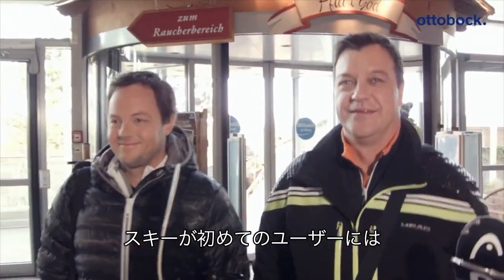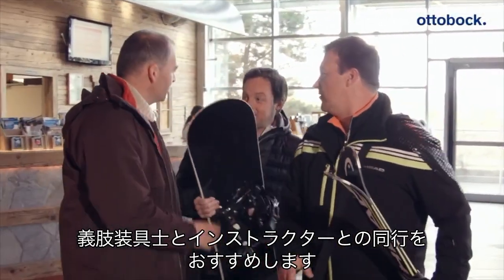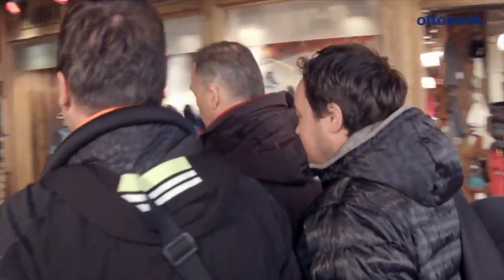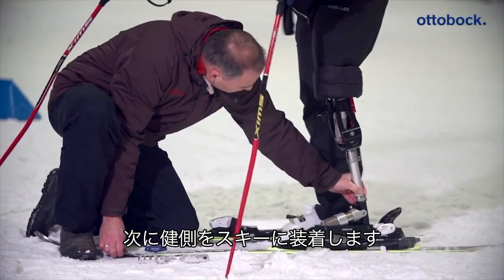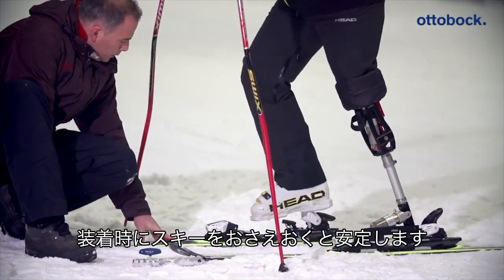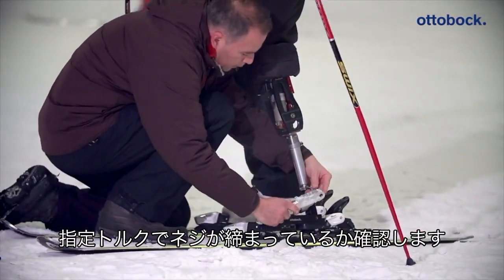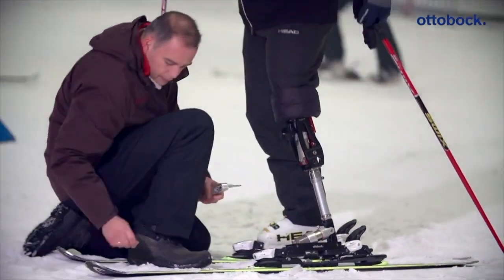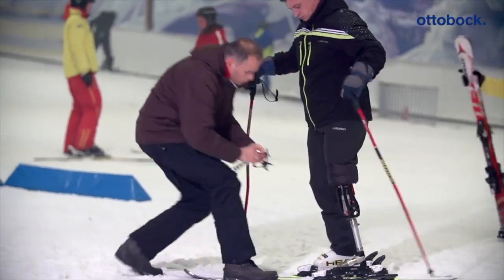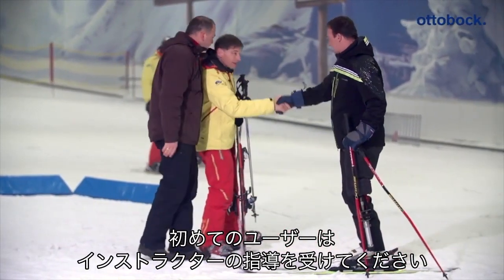For the first steps on skis, the patient should have help from an O&P professional — one who skis or snowboards if possible — and a ski instructor. An example in an indoor ski facility is shown here. Step into the bindings with the prosthesis first and only afterwards with the intact leg. Feel free to hold the skis firmly to make it easier to step into them. All screws should then be re-tightened with the specified torque. It is advisable to get professional support from a ski instructor for the initial exercises, and some sample exercises are shown.